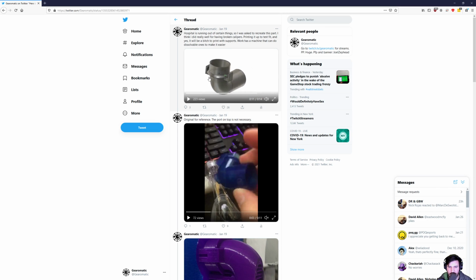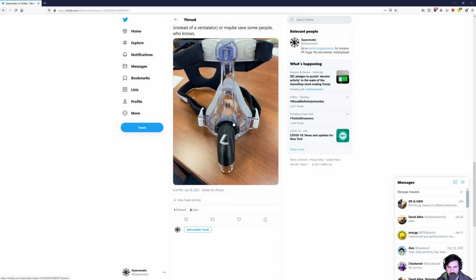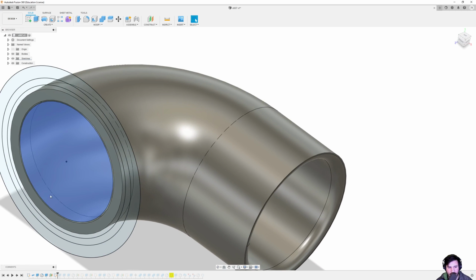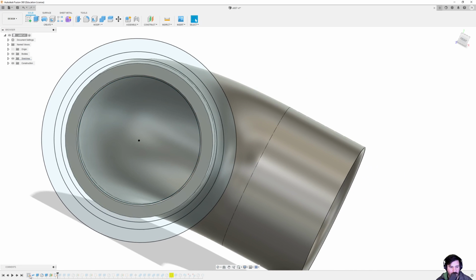It has a little bit of a fillet on it to help it seat properly against the mask itself, right along this edge right here. It just makes it a little less abrupt, more of a wedge than a flat piece. This is the actual extrusion that comes forward, and then this is the internal piece that actually interfaces with this on the inside. You can see it's actually not quite the same size, but that's okay.